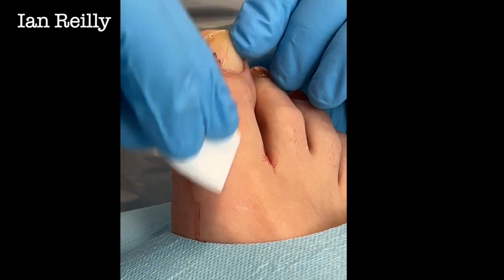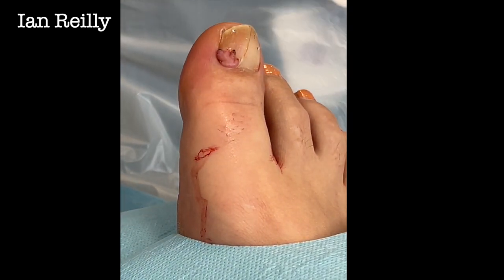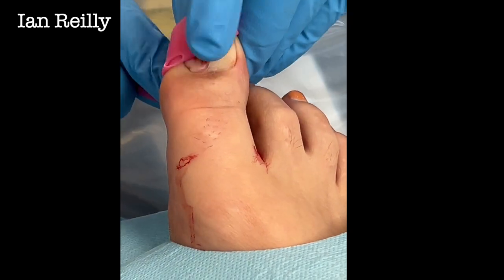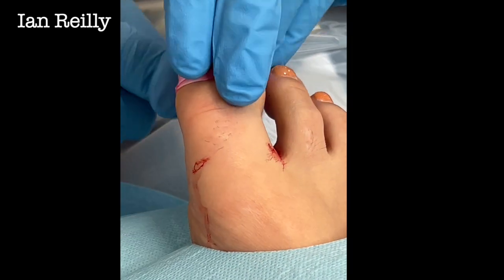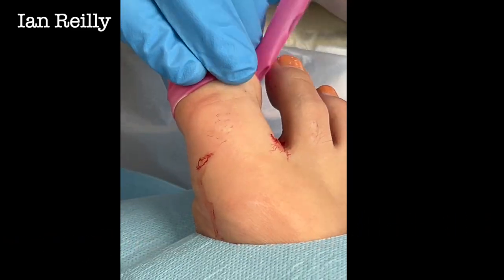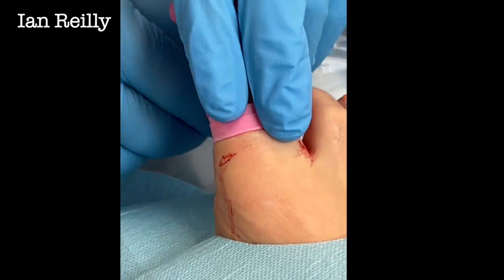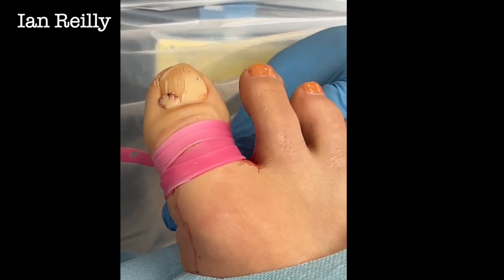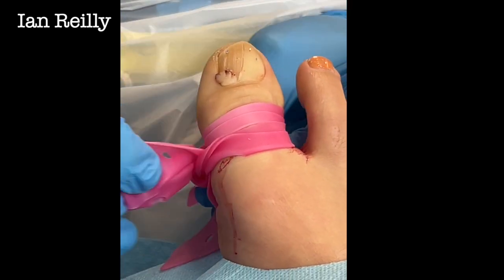I'm half talking to myself and half talking to the camera, but feel free to jump in if you're feeling lonely. We're going to do it under a little tourniquet so there's no bleeding. Exsanguinate — coming from the Latin: 'ex' meaning out of, 'sanguine' meaning blood.